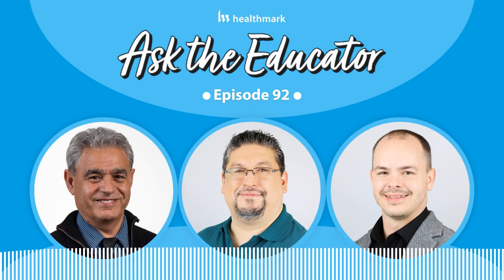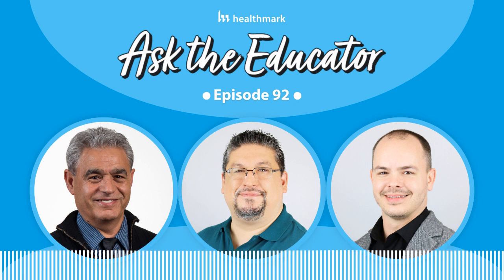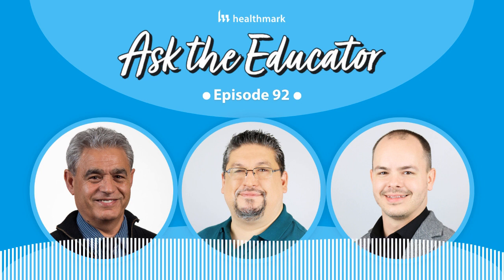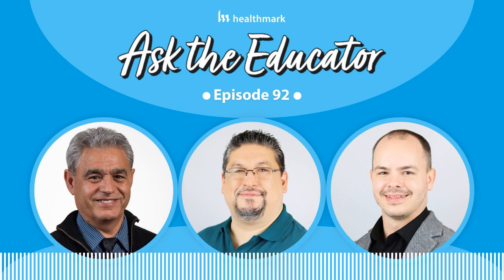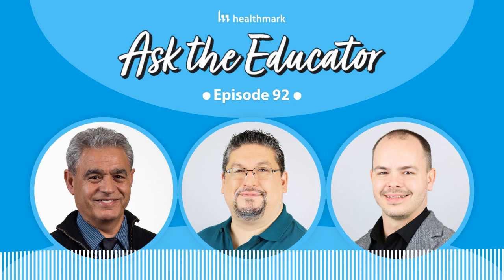The fact that he was able to keep his composure, and everyone in the room was able to keep their composure and check for fire and check for injury, was very good. But it was a major near miss. And to find out later on that these cords have limited lifespans, and all of this stuff is known, but not necessarily known by sterile processing professionals that can actually do something about it.